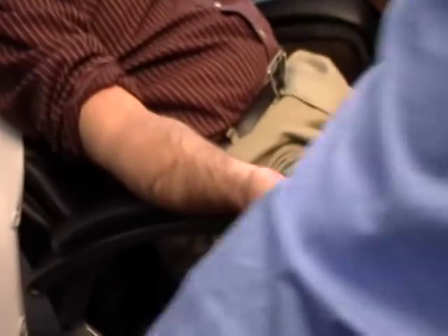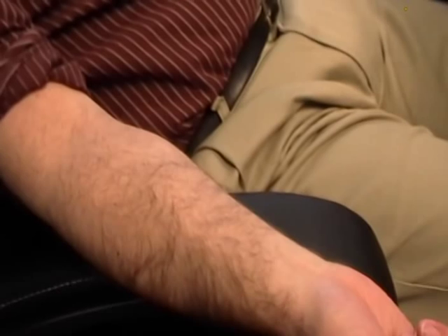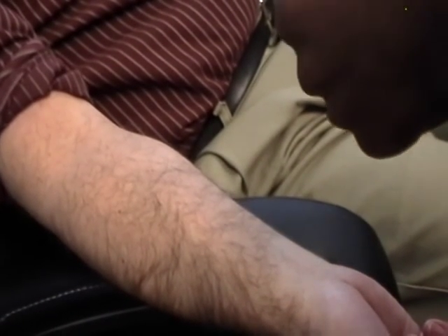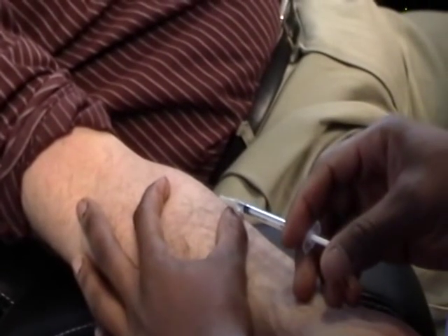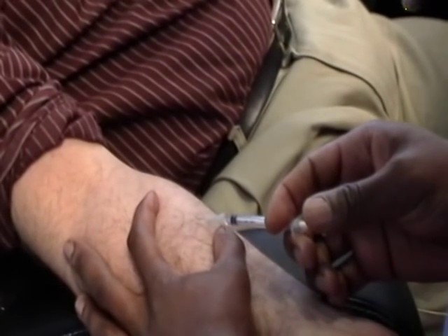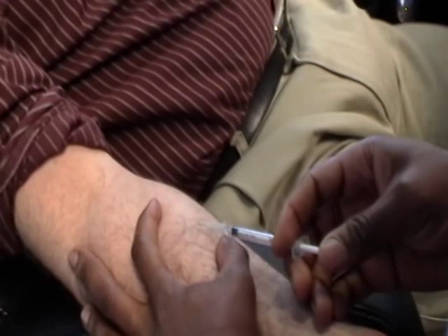So Patterson, my student here, is going to place it correctly. We're going to place it in the right forearm — I always place them in the same place on everybody so I can find them. Pull the skin taut. You go in just shy of parallel to the skin, and there should be a little wheal when you're done.